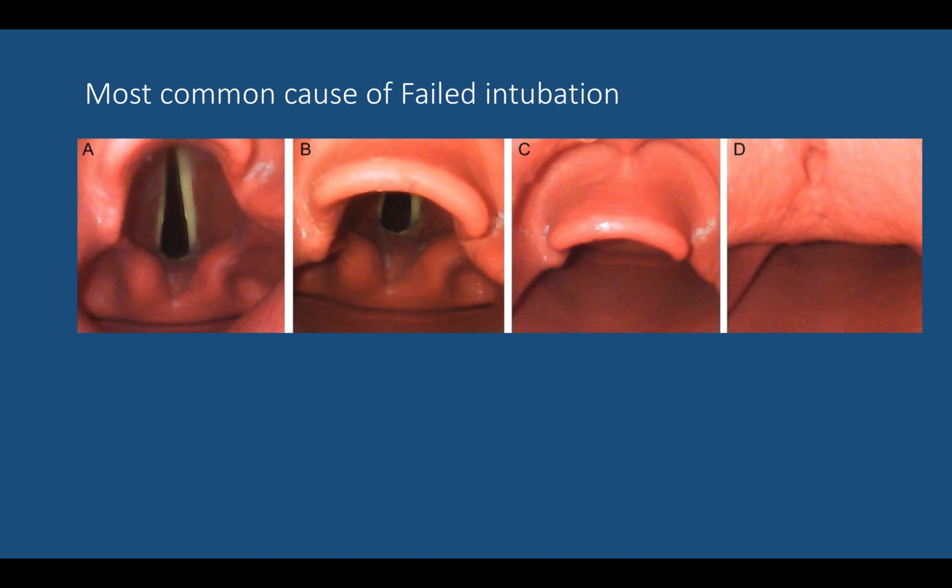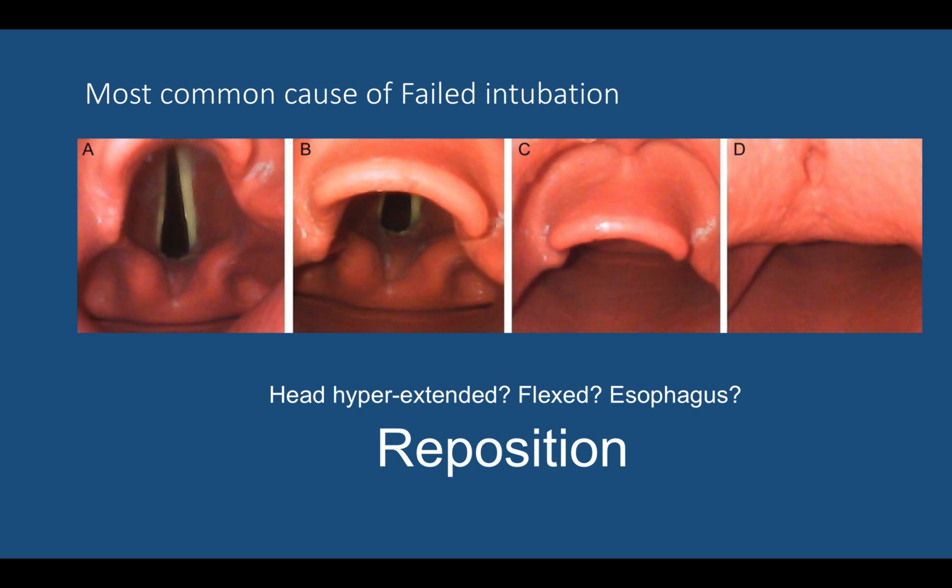One, you're going to fail at intubation. You're not going to see anything when you go in there. So you have to make sure that you're assessing whether you're actually using proper positioning technique, because as we mentioned, position is the most important thing with any procedure. Are you hyperflexed? Are you hyperextended? Are you down into the esophagus past the normal glottic opening?